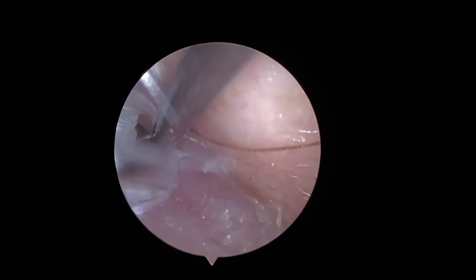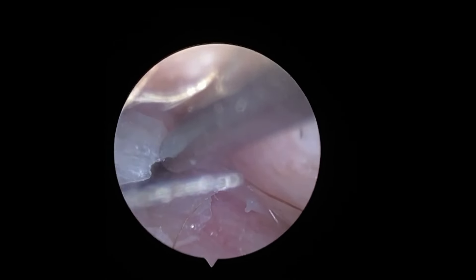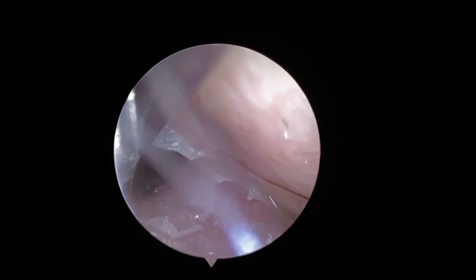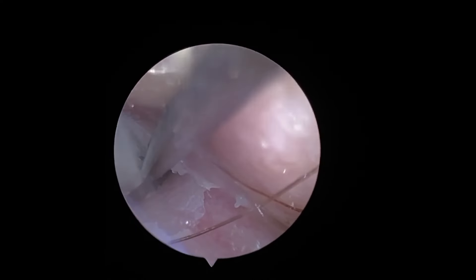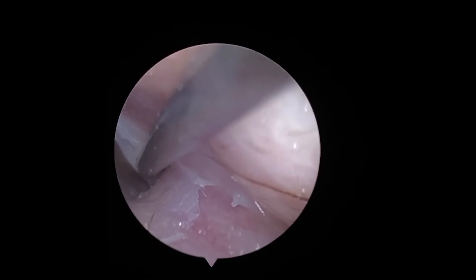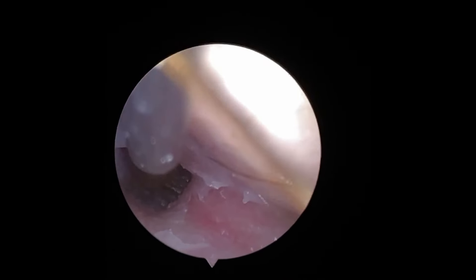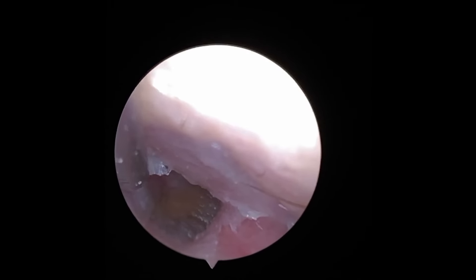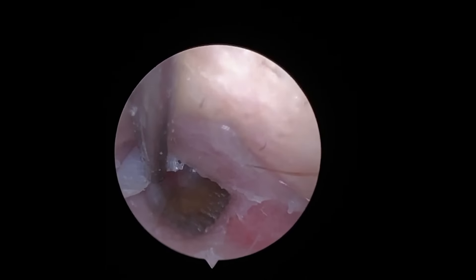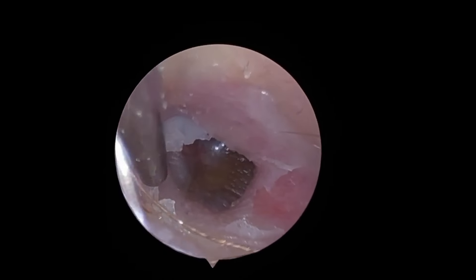I'm going in with a smaller fine end here to get the deeper parts of the keratin, and I'm moving very slowly over the areas I can see. Most are not ready to come off, but I am getting a few smaller skin pulls here and there. There is a flap of keratin right at the top of the screen which I want to take off, but it is pretty deep and after trying a couple of times it's clear it's not ready to come off — I'm happy to leave that there because this part of the procedure can get quite pokey.